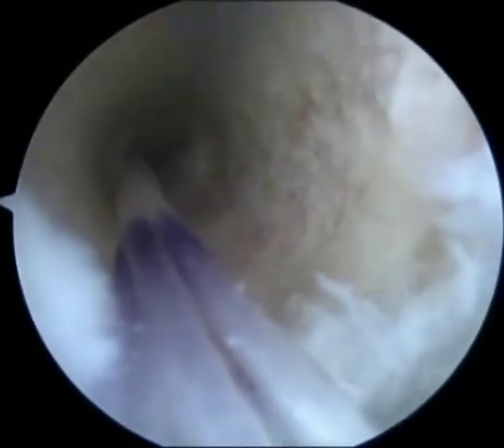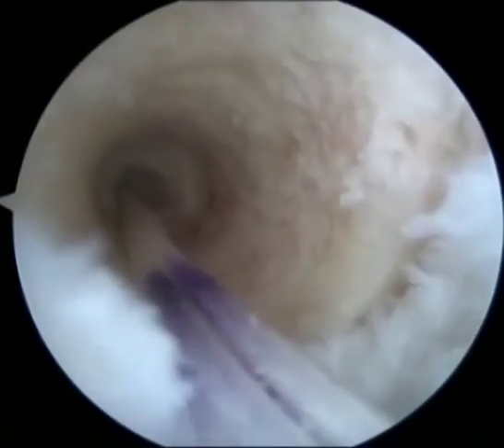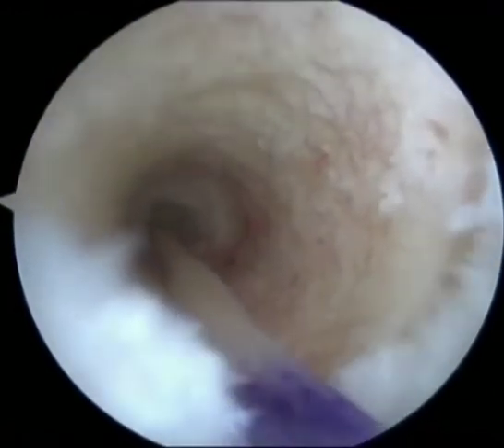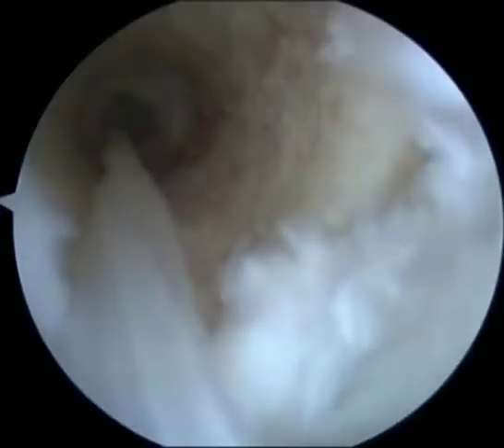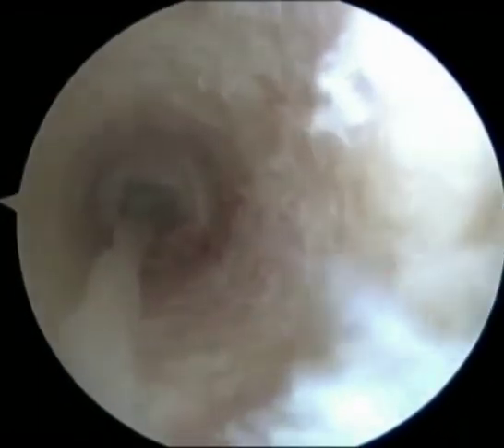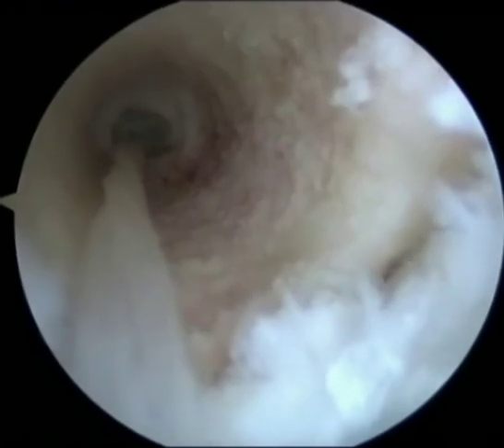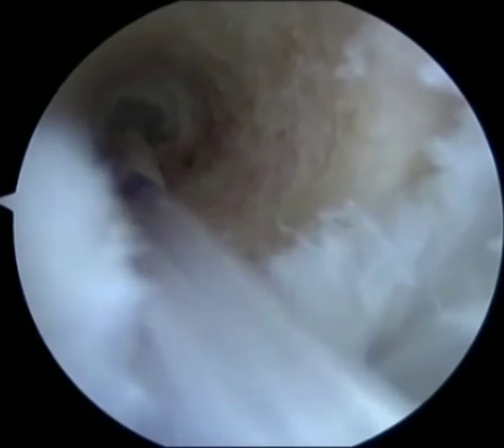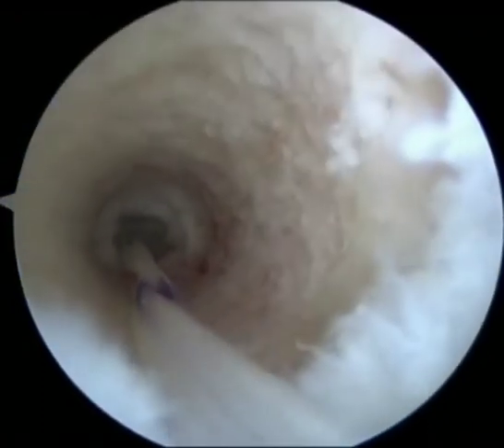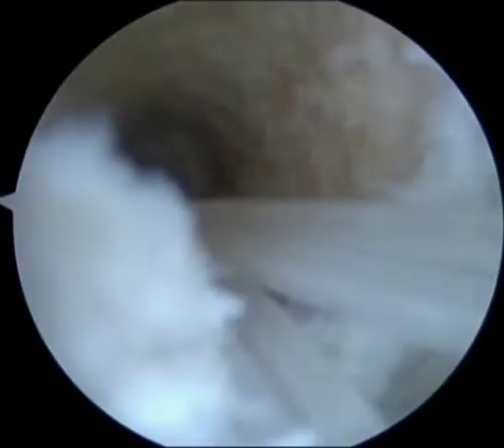The guide pin is then withdrawn and the graft is pulled from the tibial end to ensure that the button is seated on the cortex. The graft is then pulled into the socket by tightening the adjustable loop through the tensioning sutures. The remaining part of the surgery is completed without any modifications.